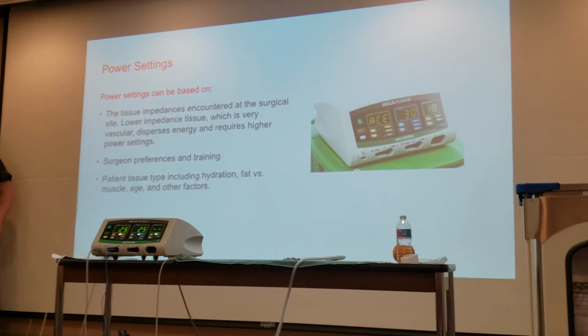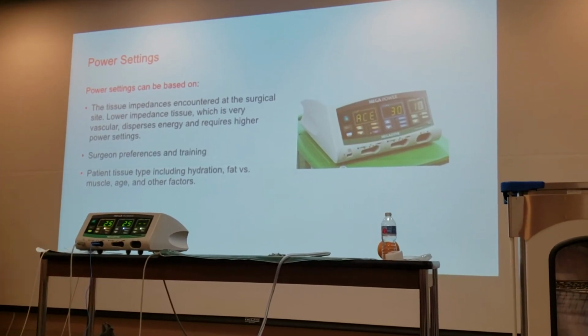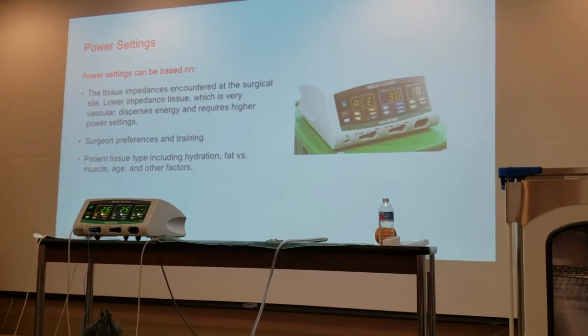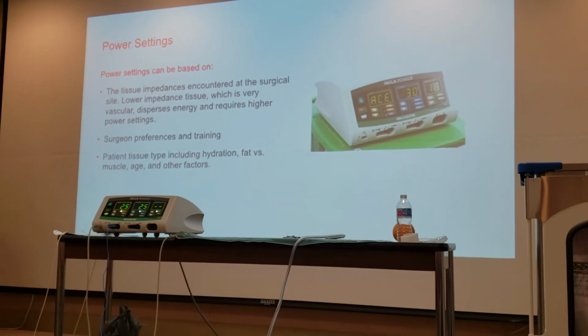Power settings can be based on a lot of things. What do your clinicians typically set them at? And if you were to ask them why they set them at that, why would they? That's how they were trained, right?